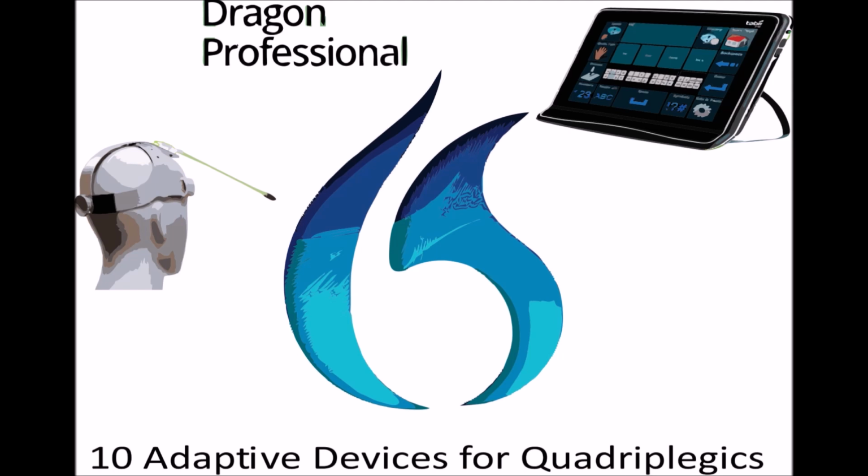Mouthsticks are typically used to help individuals perform tasks such as writing, drawing, typing, and using electronic devices such as smartphones and tablets. The mouthstick is held in the mouth and used to manipulate objects or press buttons on a keyboard or touch screen. Mouthsticks can be customized to fit an individual's specific needs and preferences, such as length and shape.